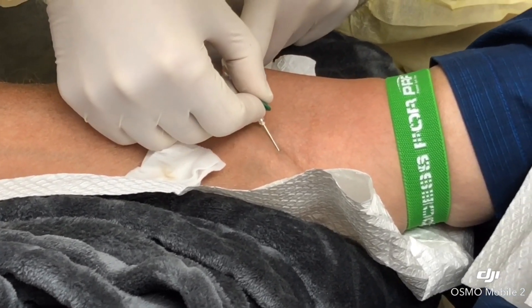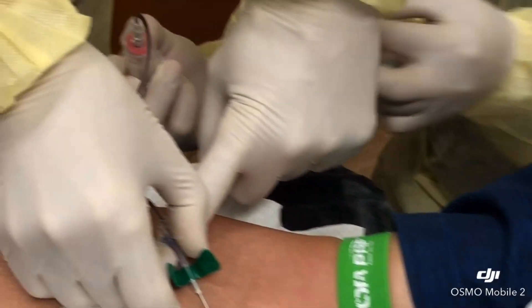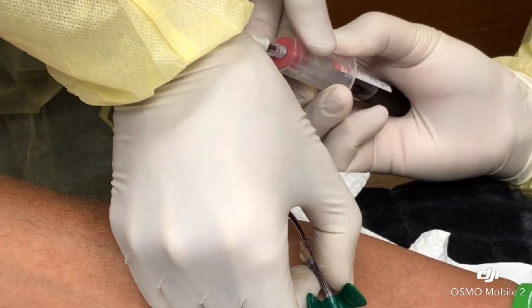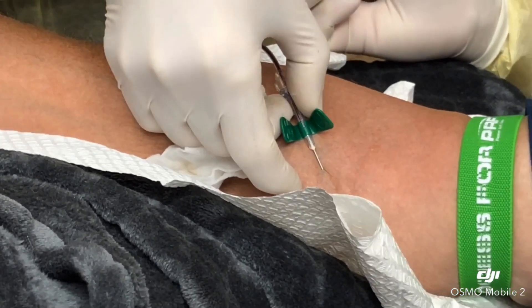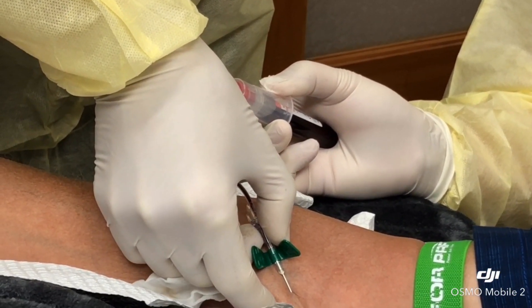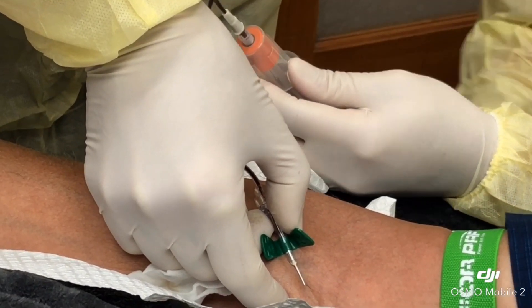This is the part where we draw blood from the patient. We will obtain a few test tubes which will be spun. That portion of the blood, which is called PRF — platelet-rich fibrin — actually gels and becomes like jello, and that will be compressed into a graft-like material.